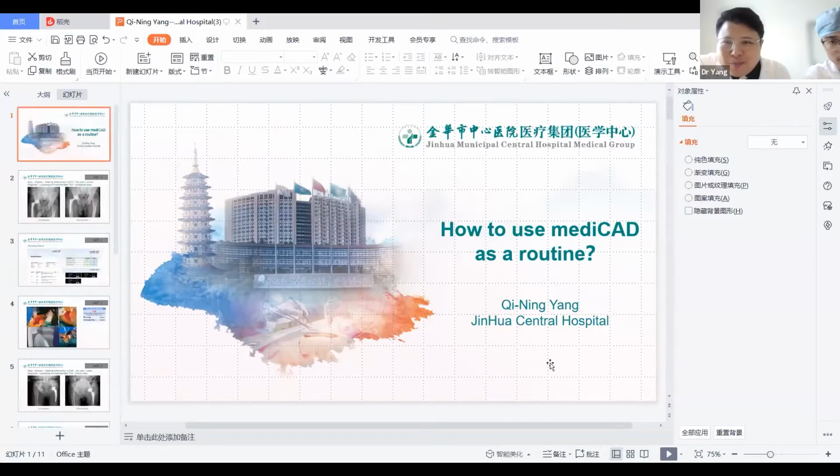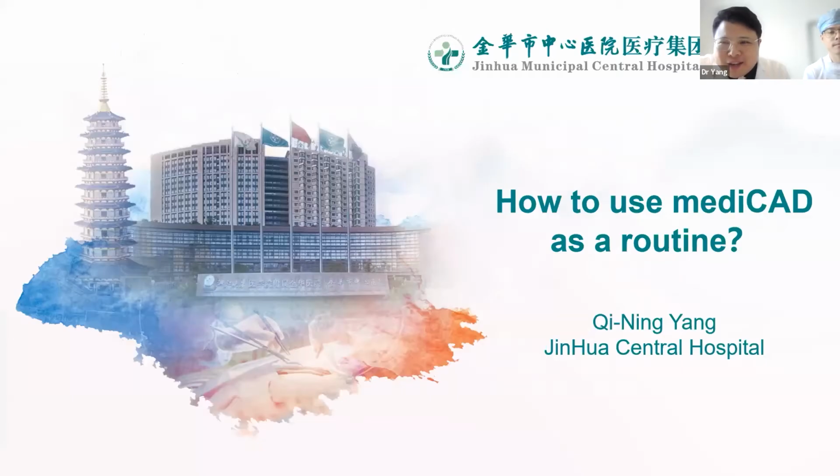Thank you for mediCAD. I usually call it mediCAD, but maybe its correct pronunciation is mediCAD, right? Yeah, right. I think this is a very good program for templating in arthroplasty.